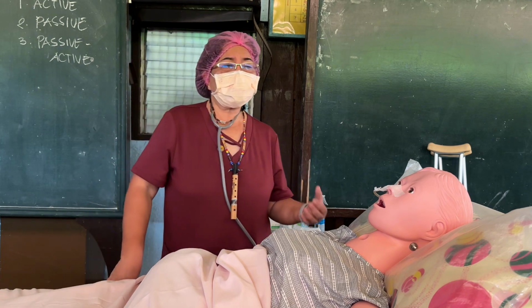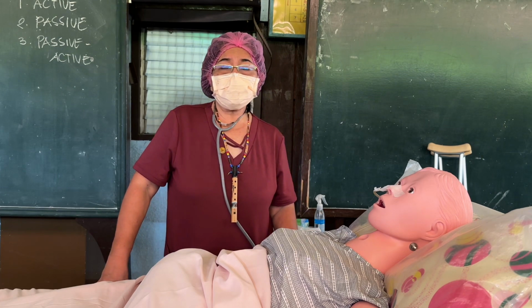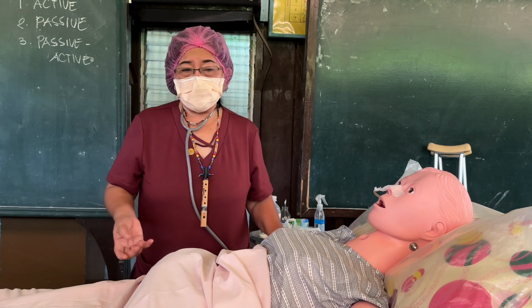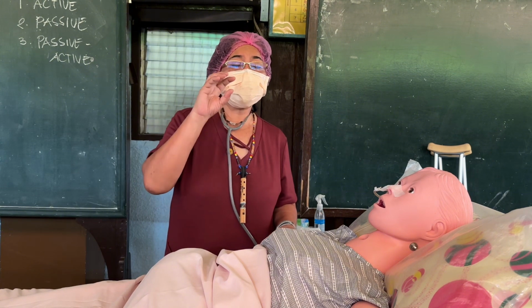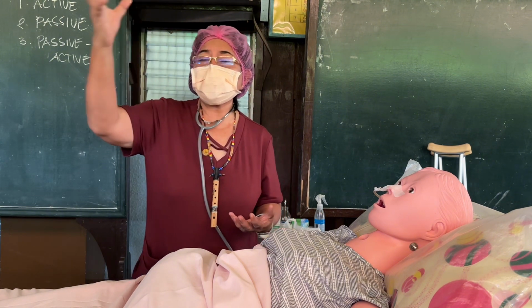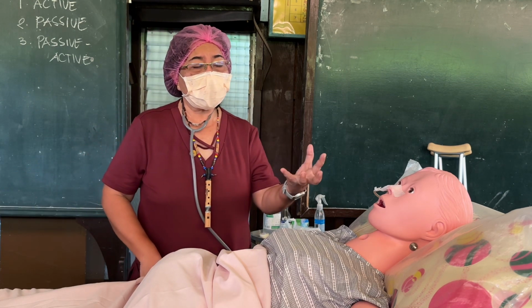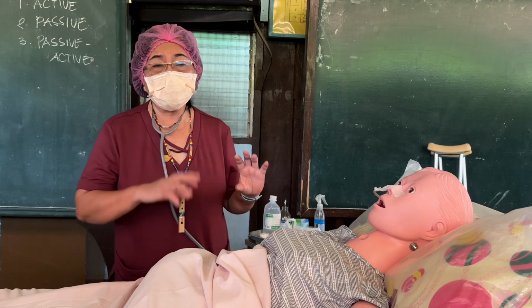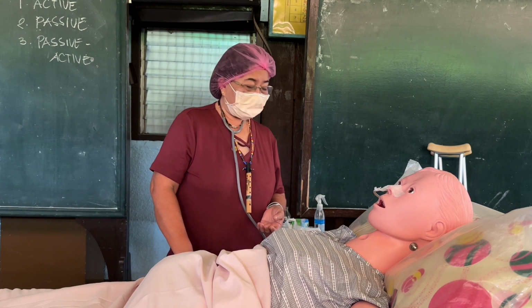So, before feeding the patient, you get the authorized feed from the rep. You put it in a glass with calibration up to 180 cc. Return the excess to the chiller. Then the portion you took, 30 minutes before feeding, you immerse in lukewarm water because it's cold.